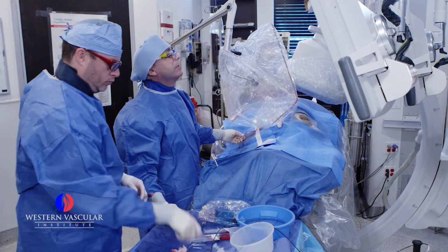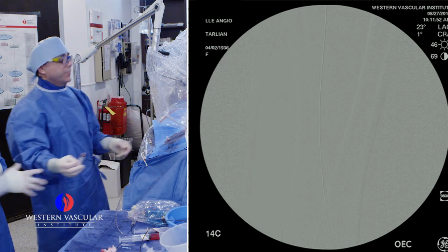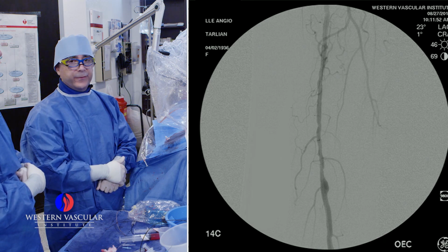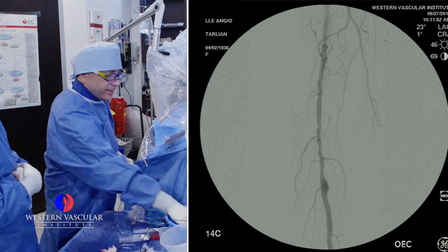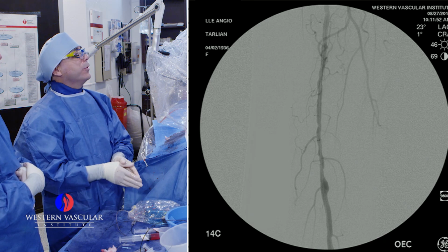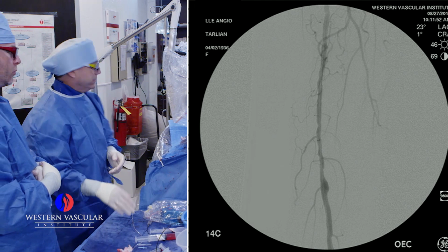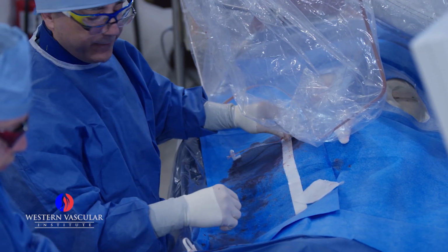A little further south. And the rest of the artery looks pretty good as well. I don't see anything severe. There are some scattered narrowings throughout there, but I don't think any of them are significant enough to warrant dilating the vessel, because every time you touch a vessel or dilate a vessel, you run the risk of scar tissue forming inside. So for her, this should take care of the problem, which is pain in her calf when she walks. So now we're going to take the sheath out, put a little closure device in the groin, and that'll be the end of it.